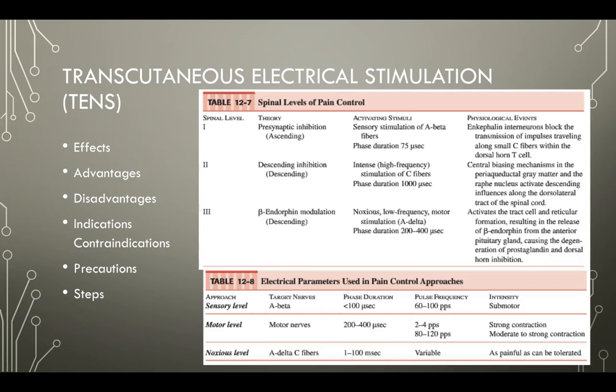So before you can have some of those settings in place, get those in place, then we can get the pads on the individual, depending on what type of pads you're using. You can set up your pads in any of our arrangements, okay: the monopolar, the bipolar, the bifurcated. You can do the quadpolar setups, but they're not true IFC setups because it would be two different channels running, but you can do the cross or you can do the parallel. You want to make sure you have good contact with that.